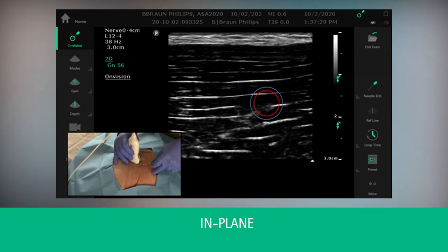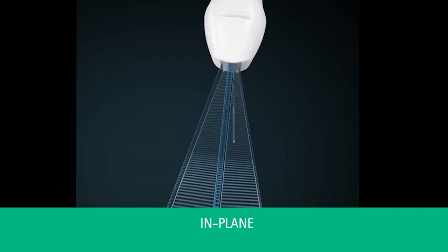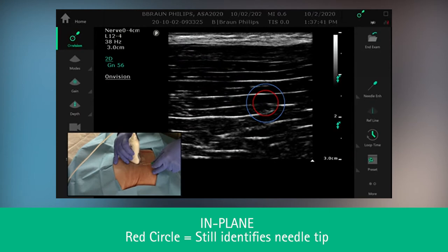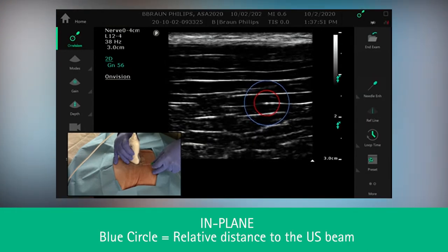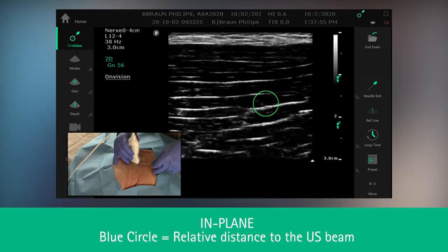If you were to translate off of the needle shaft so you are out of the ultrasound plane, but you are still within the OnVision zone, you will notice the green circle transitions to a red and a blue circle. The red circle still identifies the location of the needle tip. The blue circle will expand as you move away from or contract as you move towards the needle tip.